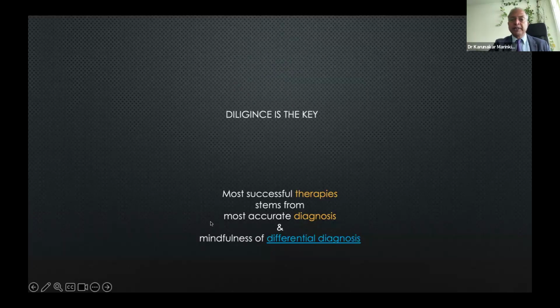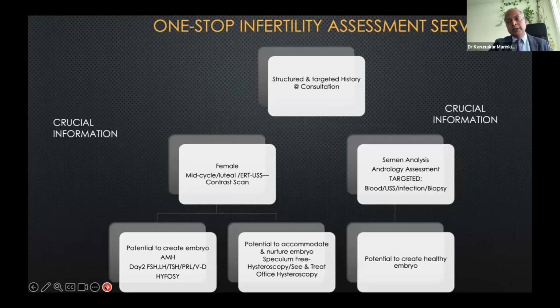You must always be mindful of the differential diagnosis, and you must be mindful of limitations of ultrasound, contrast ultrasound, 3D ultrasound, hysteroscopy, laparoscopy, even IVF PGT. Every technology has limitations, and nature is far more powerful than whatever diagnostic technology as well as the expertise. We need to be mindful of that for you to be sustainable, evolving the biological evolution.